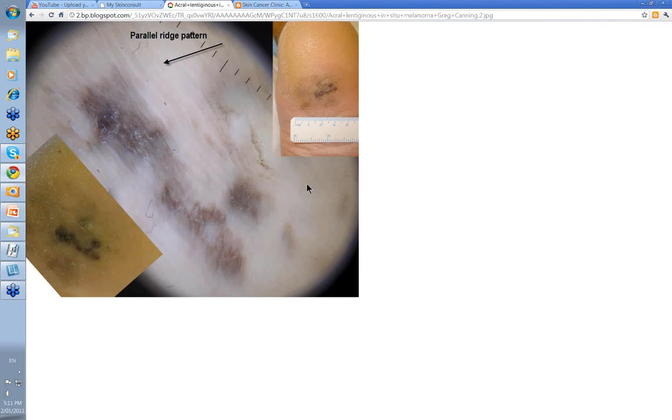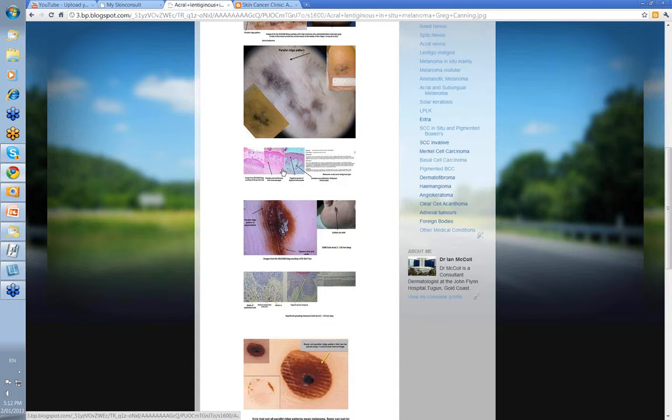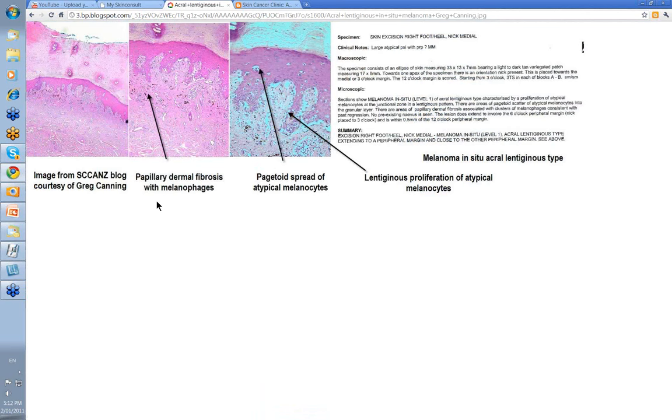This one is from Dr. Greg Canning from Townsville. Look at this lesion on the heel towards the instep — diffuse, with darker pigmentation. You might think it was a bruise. But with the dermatoscope you've got your typical parallel ridge pattern, a bit darker here, but go out towards the edges and you can see this parallel ridge pattern clearly. Looking at the histology, there was some papillary dermal fibrosis with melanophages — those are the brown things — and the pink is the dermal fibrosis.